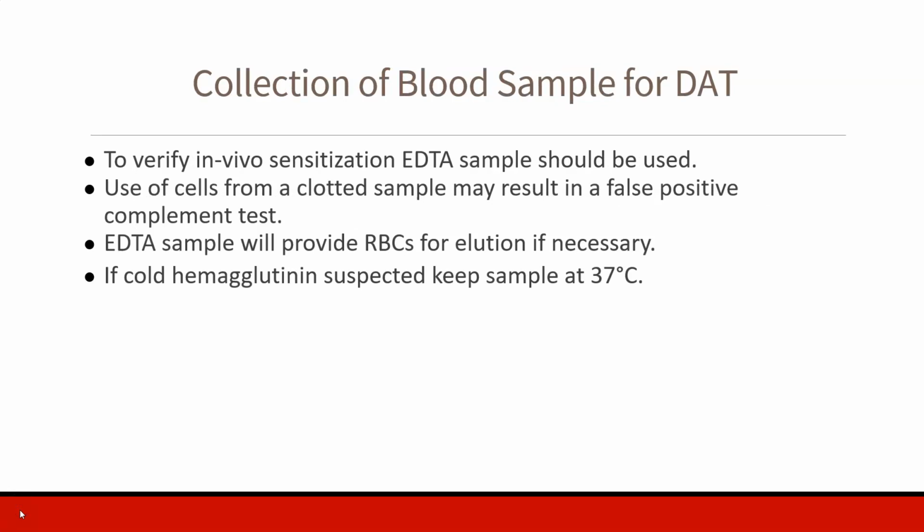To verify in vivo sensitization, EDTA samples should be used, and I would like to say must be used. Now, if you're using clotted samples for your pre-transfusion testing, you can test a drop of the clotted sample and see if it's positive or negative. Because if it's negative, you're good to go. You don't have to redraw the patient for the EDTA sample.